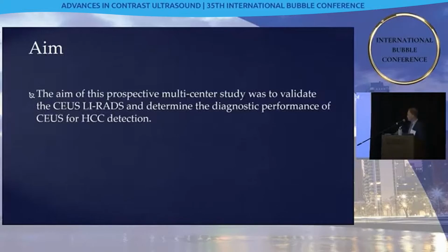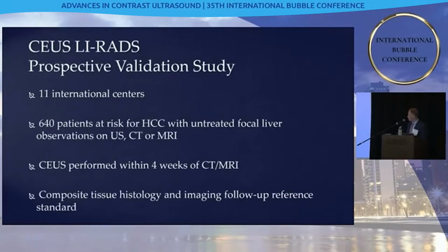So we did a study, and the aim was, in a prospective multi-center trial, to validate contrast-enhanced ultrasound LI-RADS and determine the diagnostic performance of contrast-enhanced ultrasound for HCC detection. We went a little bit crazy, but I'm glad we did.